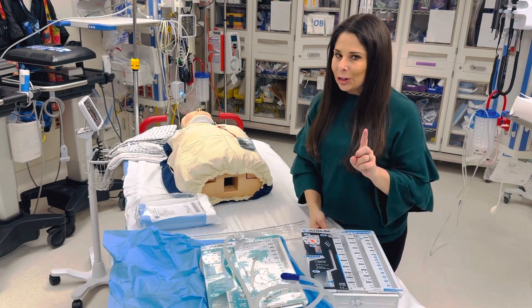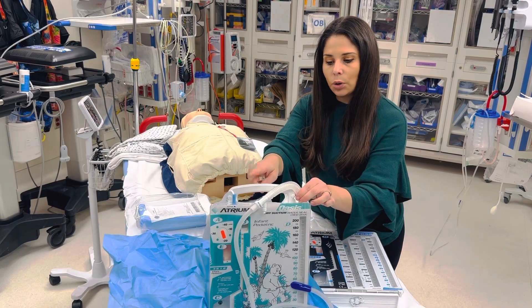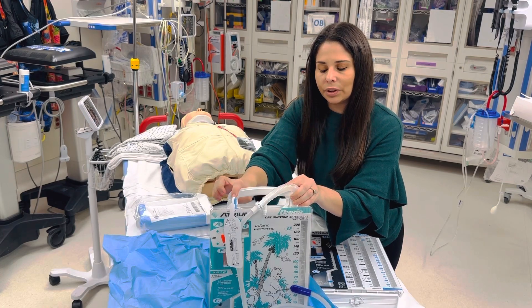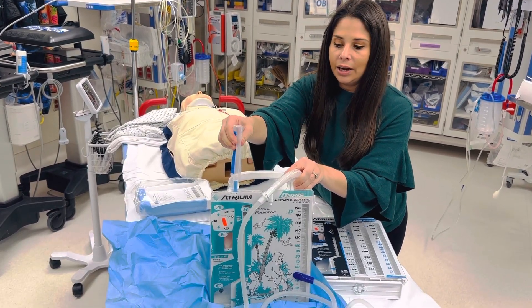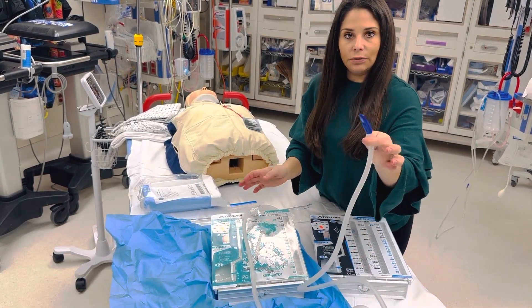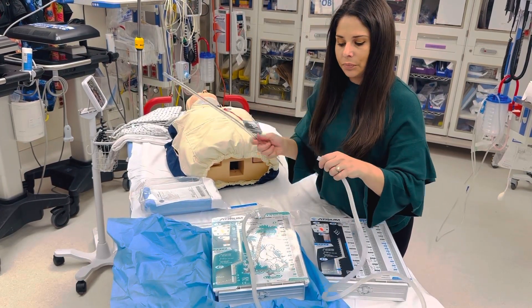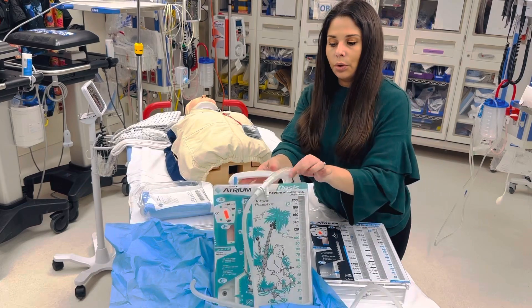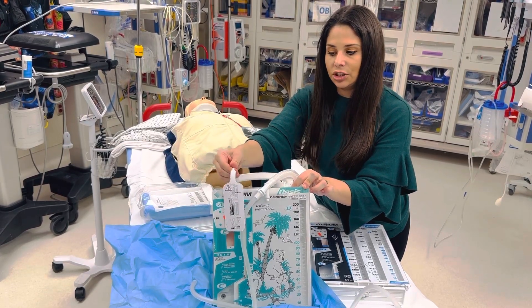Setup is a little bit different for each. If you have a water seal chest tube, take it out of the box. Notice this little tag right here inside your suction port — remove this, and that is where you will fill up your water. Your water will go through your suction port. This end of the tube connects with the chest tube coming out of the patient, and then you hook your suction up to this piece right here.